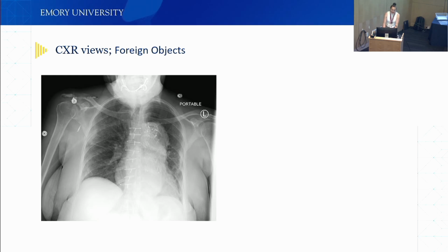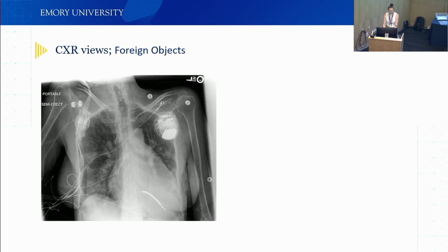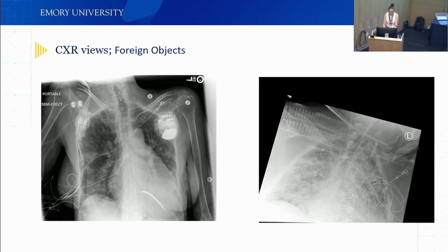Which, let's be very honest, if you have sternal wires, there's a very big chance you had either bypass surgery or something similar. So it might not be the worst thing, but you didn't see myocardial infarction. You see sternal wires. It's the same with pacemakers. So here you see a pacemaker. This is the pacing wire. It's in the heart. If they're there and you're predicting cardiovascular outcomes, most of the time people with pacemakers have worse outcomes than people without pacemakers. You're not looking at actual disease, you're just looking at the presence of a pacemaker.